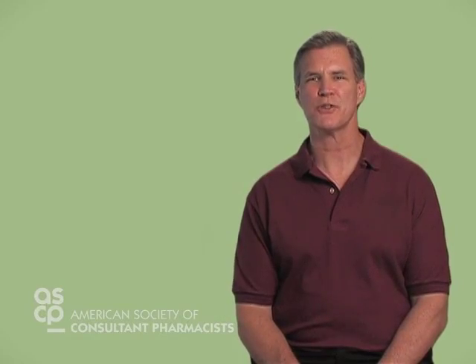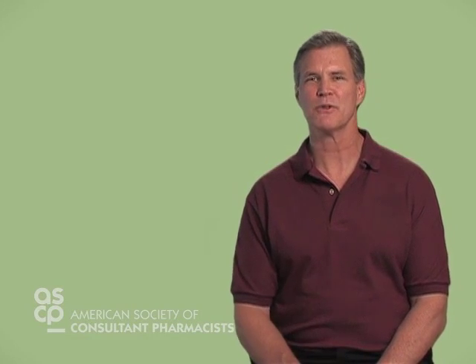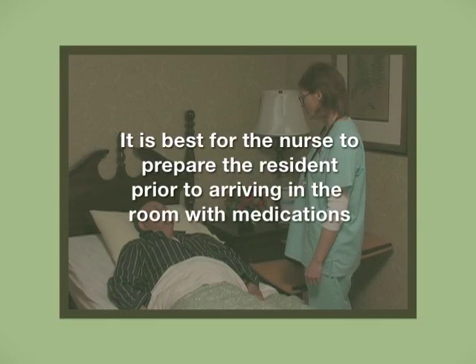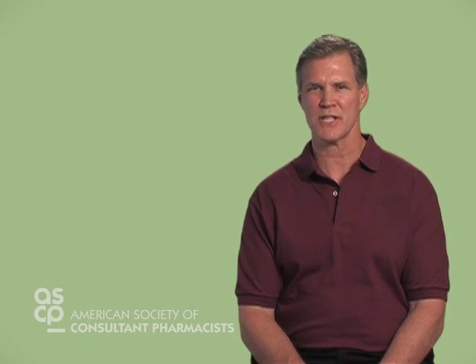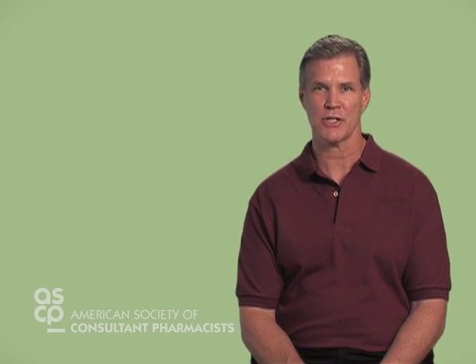We have reviewed the procedure for administering medications by way of a G-tube and presented some potential G-tube related complications. Now let's review the information with a few situational questions. True or false? It is best for the nurse to prepare the resident prior to arriving in the room with medications. The answer is true. It is much more efficient to assess for pain and obtain any needed medication parameters prior to preparing routine medications than discovering later that an as-needed pain medication is requested or a blood pressure tablet should be held.